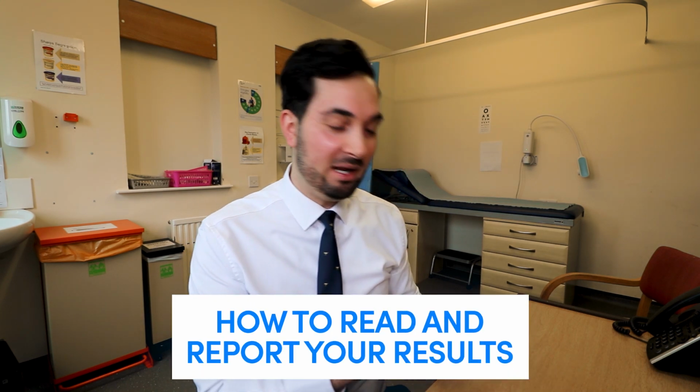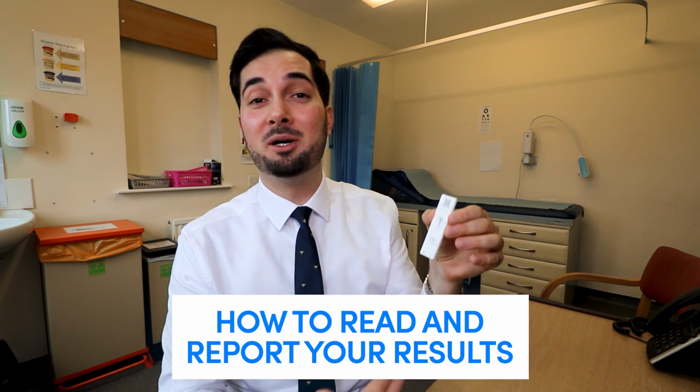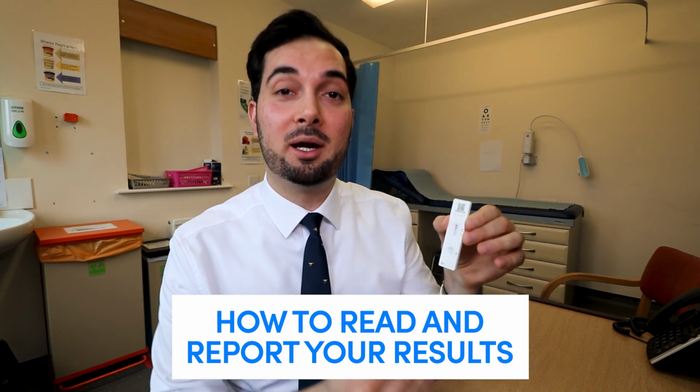Okay, so I hope you're finding this information useful so far. We've gone through the step-by-step instructions. Now let's look at results, okay? So it's been half an hour now, my phone timer has gone off, so now these results are ready to look at. Please remember, any result before half an hour is not accurate, so you need to do it for half an hour and then look at the results. If you leave it for an hour as well, it might no longer be accurate, so you need to put that timer on, and at half an hour once it's gone, or whatever time it is for your testing kit, please remember that, because your testing kit might not be half an hour, put that timer on and look at it exactly at that time, and that is your result.